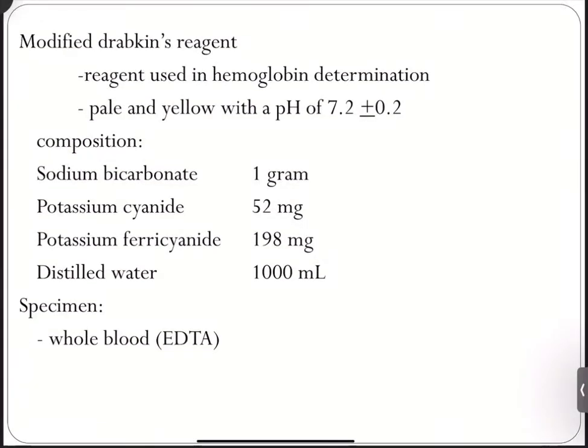Okay. The content of your modified Drabkin's, no? Yan. Sodium bicarbonate, potassium ferricyanide, potassium cyanide, and distilled water.